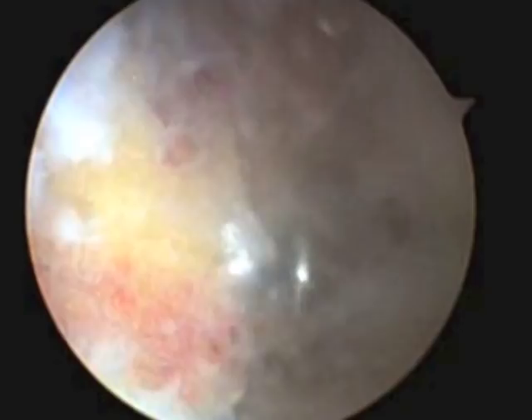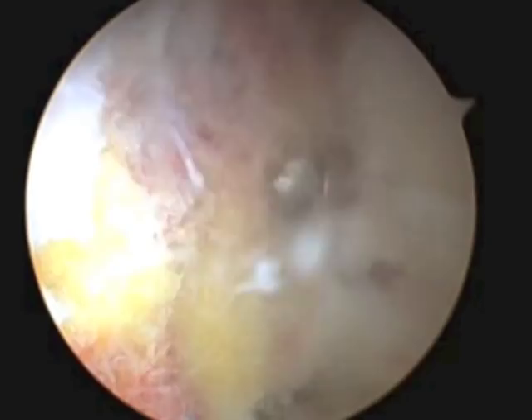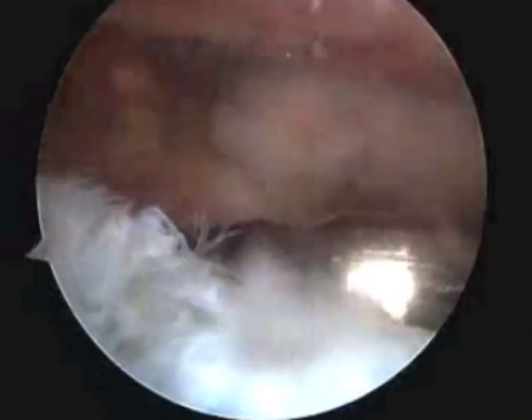Luckily enough, with keyhole surgery, we can preserve all — or most — of the ligaments that surround this joint, meaning that the joint is still stable and patients have excellent function of the shoulder. And here is the end result.